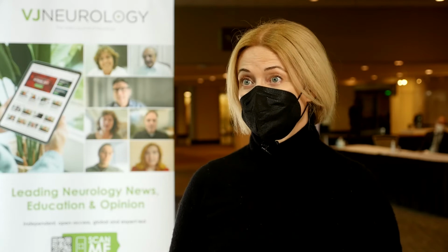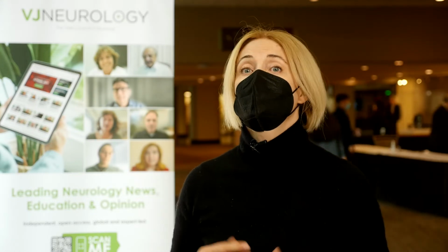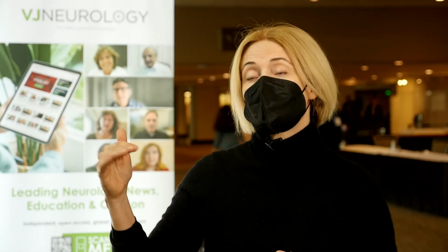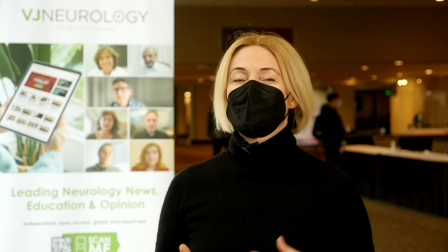Maybe 4 weeks would have been better, because what we find is that people in the sham, so the apparent stimulation, go back down. Although they improve because they undergo intensive rehab, they go back down to almost close to baseline, while people who have received the real stimulation keep improving or stay the same. And so this is important if we consider the mechanisms of plasticity that require continuous rehearsal, and probably the sort of gain that was obtained with magnetic stimulation was kept perhaps because of continuous training by the people when they went home.